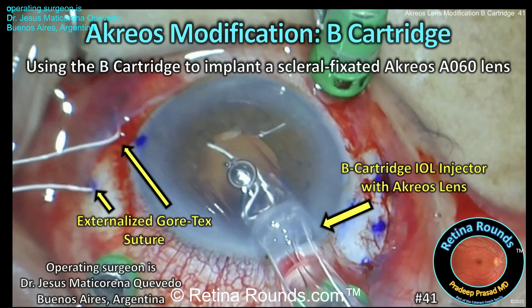Retina Rounds, episode number 41: Akreos modification using the B cartridge. In today's episode, guest surgeon Dr. Jesus Maticorena Quevedo, who's a retina fellow at the Fundación Zambrano in Buenos Aires, Argentina, is going to demonstrate how to use a B cartridge to implant a scleral fixated Akreos lens. We want to thank Dr. Maticorena for sharing this case.